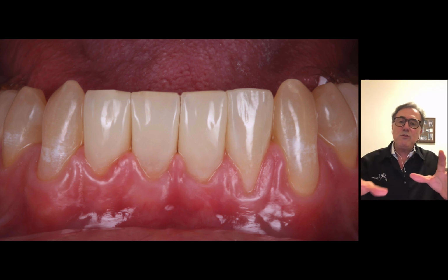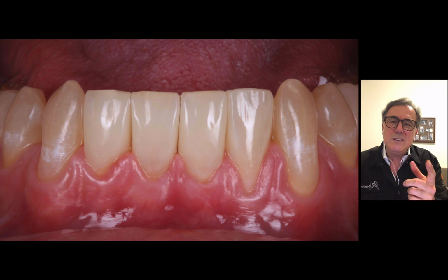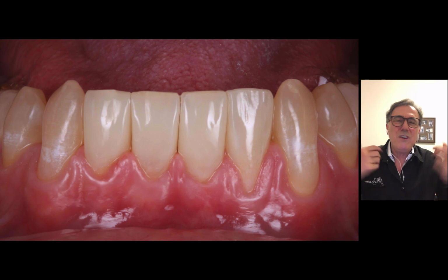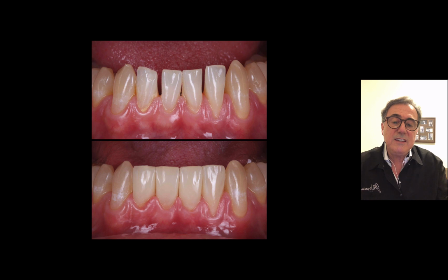Sometimes, if you haven't heard about injection molding, you might find it pretty different, but it's very easy to do. Of course, you have a learning curve, but it doesn't take you too long to learn. And once you master it, you're going to see it's very fast and easy to do the four restorations. Very simple. So that's the case. This is the case before and after.